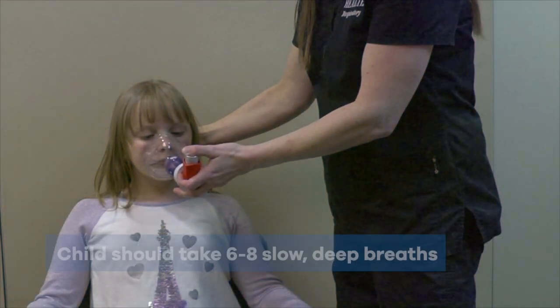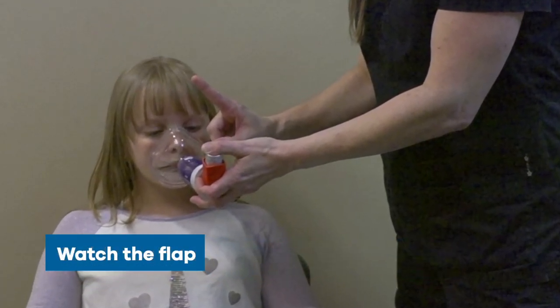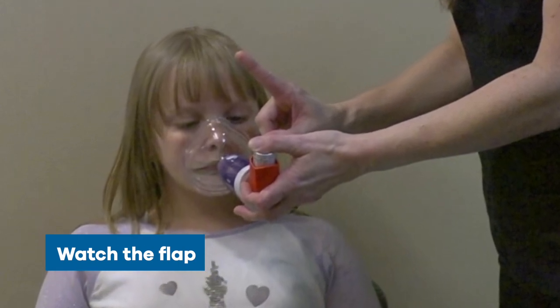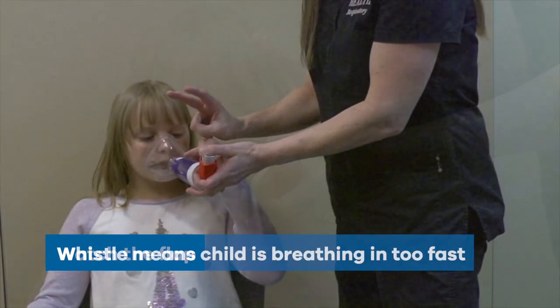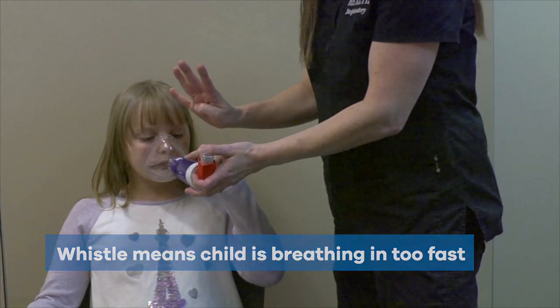Step 7: Hold the mask in place for 6 to 8 slow, deep breaths. Watch the flap on the top of the spacer — this flap goes up and down with each breath. If you hear the spacer whistle, your child's breathing in was too fast.